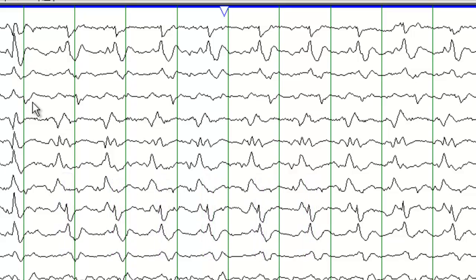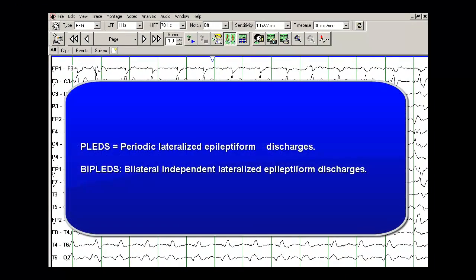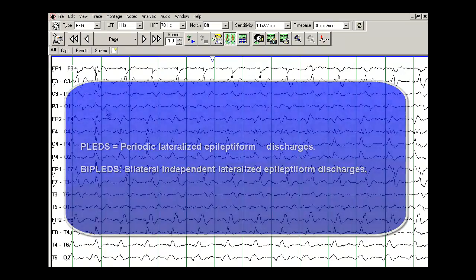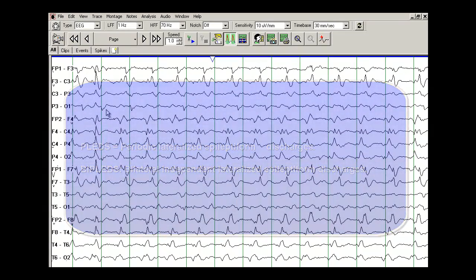So this kind of pattern is called BIPLEDs. This is different than PLEDs which stand for periodic lateralized epileptiform discharges and are predominantly just on one hemisphere.